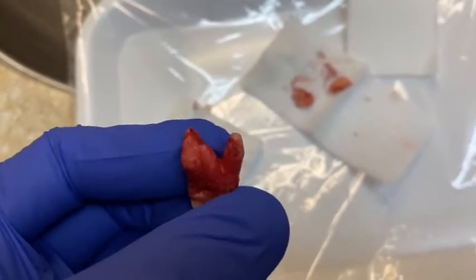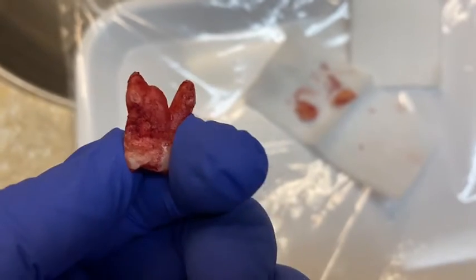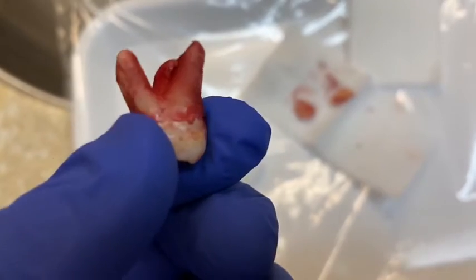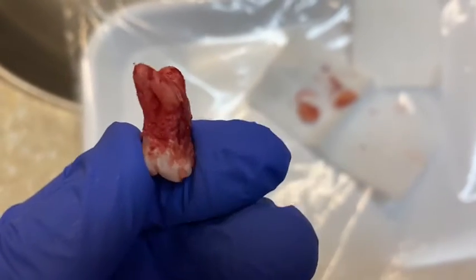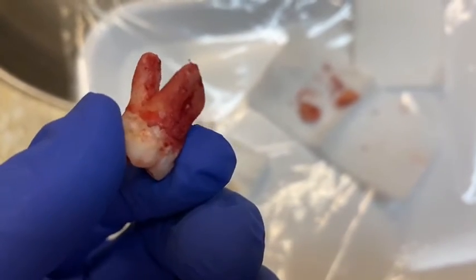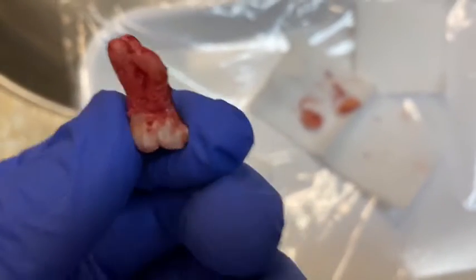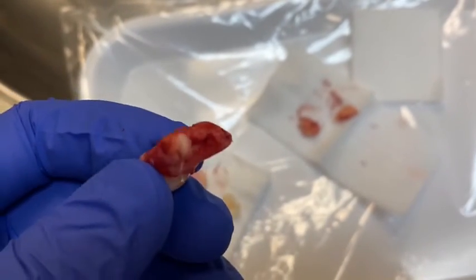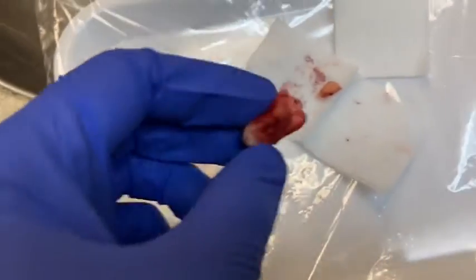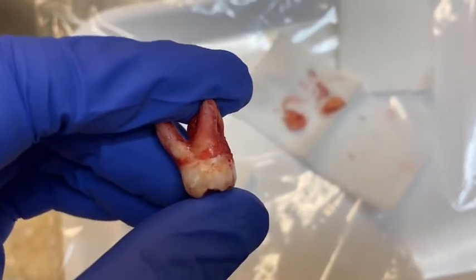It wasn't a simple elevation process. It took me several different kinds of elevators to do this. That is difficult. That's why sometimes when you evaluate the panoramic x-ray only, you may miss the aspect of the palatal root, the curve of the root, so be careful. Sometimes it can look simple, but it could be really hard.